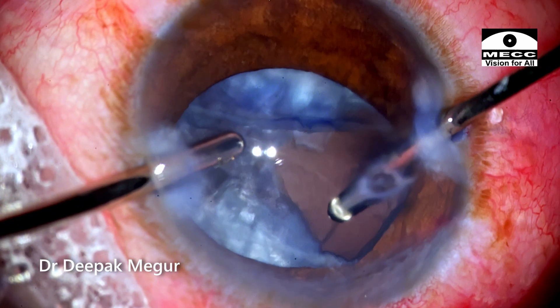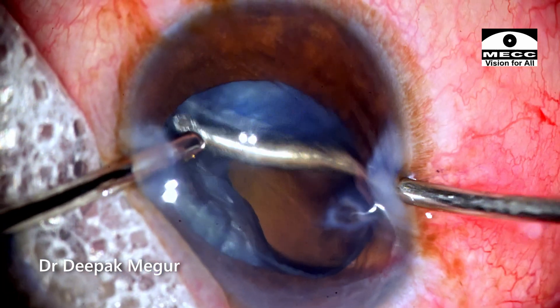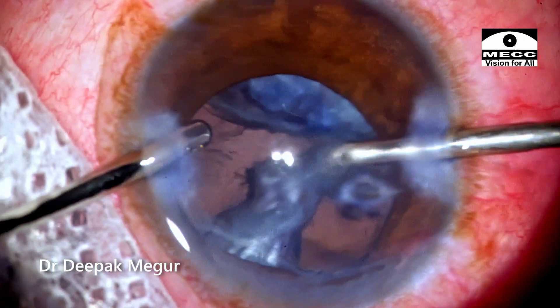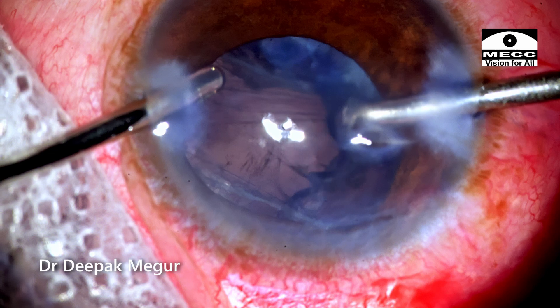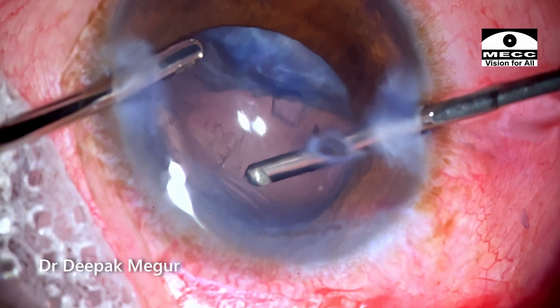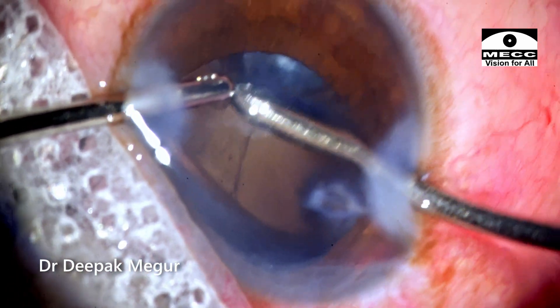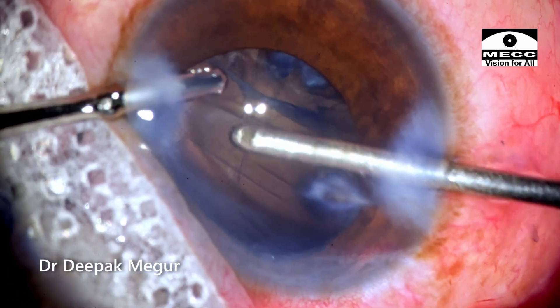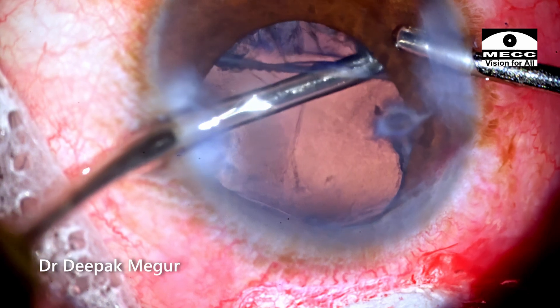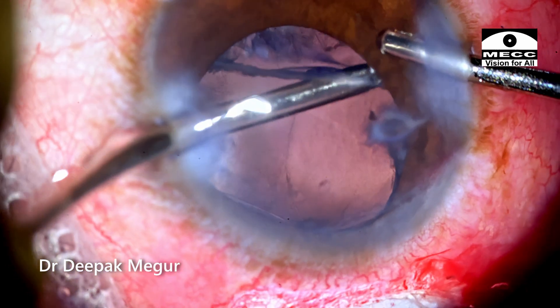It's mandatory to understand that in the presence of vitreous prolapse, aspiration of cortex or any lens matter is contraindicated. When trying to aspirate the cortex, tugging or pulling vitreous fibers invariably transmits traction to the vitreous base, causing giant retinal tear. So unless vitrectomy is done and the area around the posterior capsule is totally free of vitreous, we should not remove cortex. Even during cortex aspiration, vitreous may re-prolapse — stop aspiration, redo the vitrectomy, then switch back to aspiration. Patience is essential, and a good vitrectomy unit makes this complex case extremely manageable.